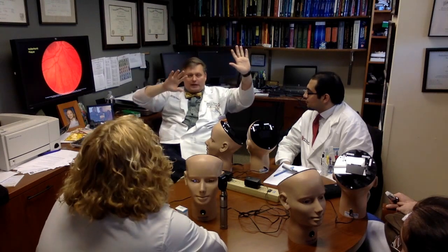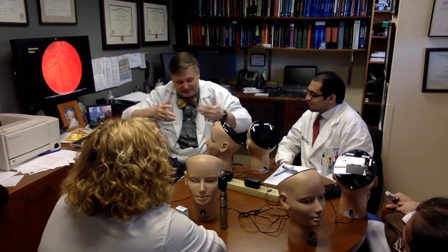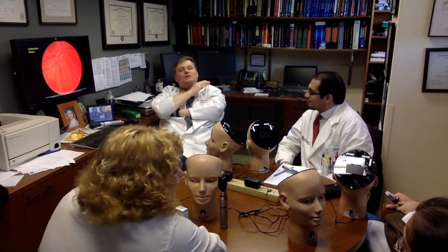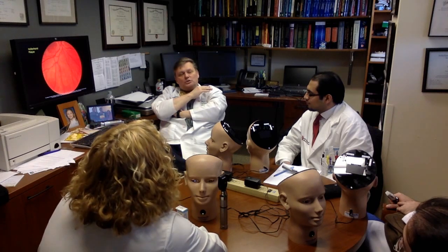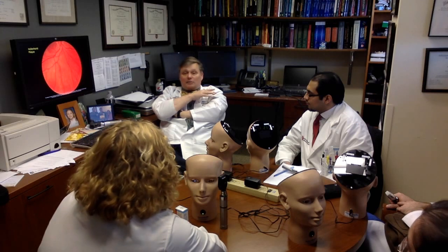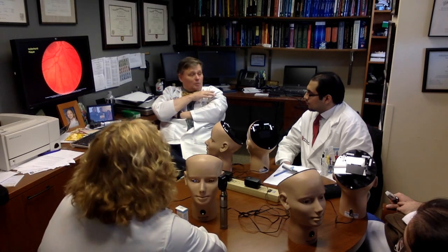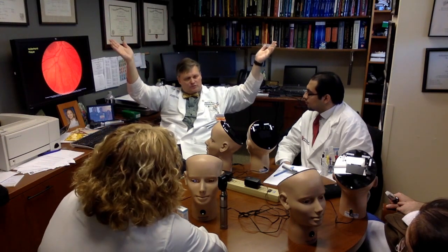Now, if the person's totally wide awake, that type of thing. So don't ever dilate one eye, please. That'd be really asking for it. You could do that, don't get me wrong, but you've got to write it down. When would you not dilate the eyes? It's really under the situation where you can't afford to lose the pupillary reflex. So it's like trauma. Someone comes in and they're in a coma, but their pupils react. You need that sign to follow.